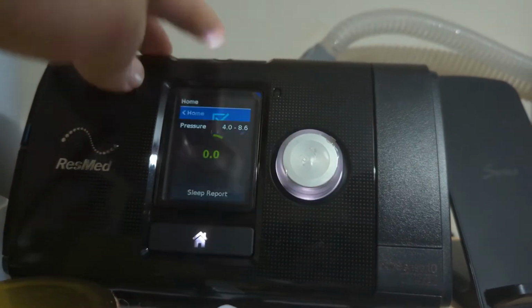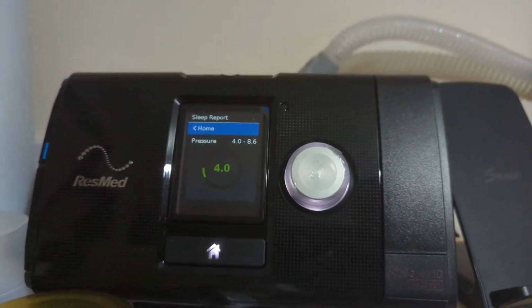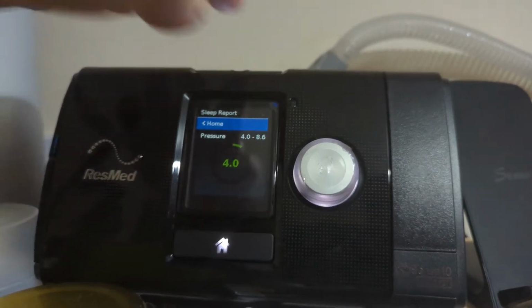So I will show you a quick image of how the CPAP machine works. I'll turn it on and show you what it means. Basically, on the screen there is a button, you press the button above it and that turns on the machine. Then the machine will go to a preset pressure. When the machine hits that preset pressure, and it knows it's hit that pressure because it's gone onto the mask, and it kind of knows the pressure that's being put from the machine through the tubing and into the mask, it will then be constantly assessing whether that pressure is enough.